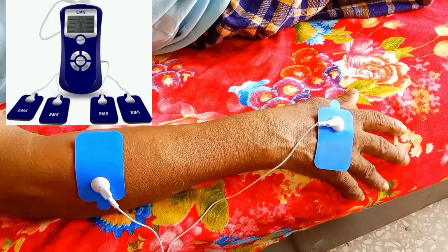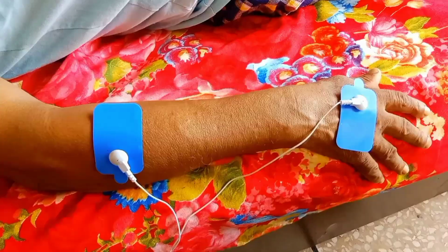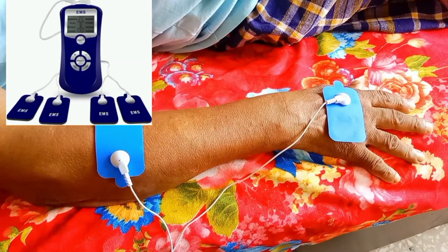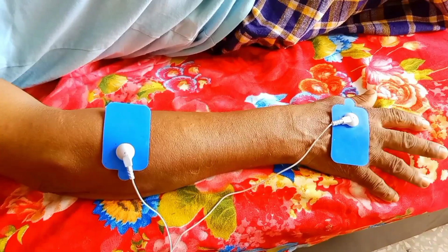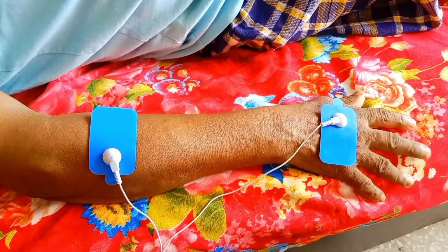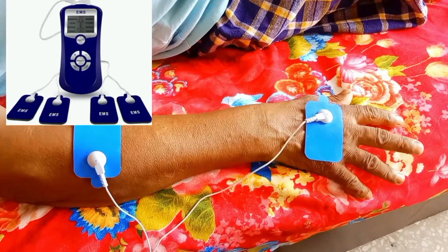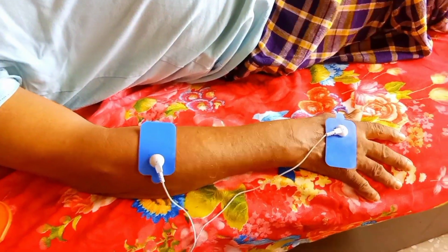EMS aids in physical therapy by strengthening muscles and improving range of motion. EMS application to help patient recovery from injuries or surgery. EMS application to improve muscle strength and endurance. EMS used to manage chronic pain and reduce muscle tension.